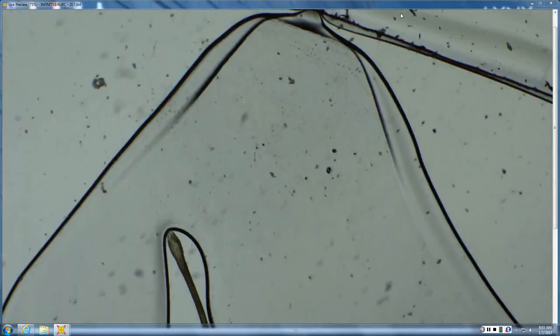Okay, so this comes into you, a bag full of hairs, all of which look just like that. So what kind of hairs are they? It's a club hair. Telogen hair, so that would go with usually telogen effluvium.